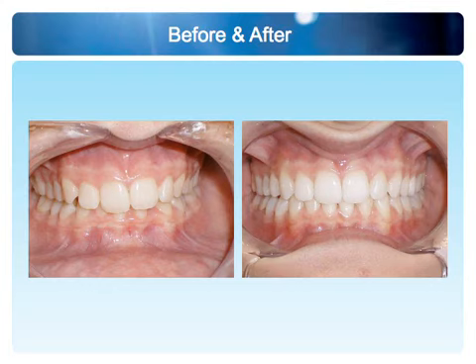And so, by establishing all of the things we talked about, recognizing that the maxillary arch form has to be addressed, recognizing that width has to be accurate, and recognizing that the buccolingual inclination of those posterior teeth has to be appropriate, it starts setting up a position where you can have overbite, overjet, canine guidance, and not to mention keeping all of the teeth.